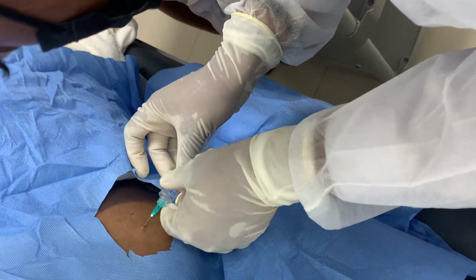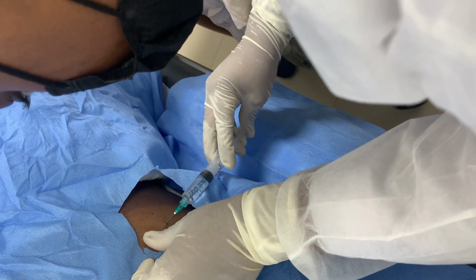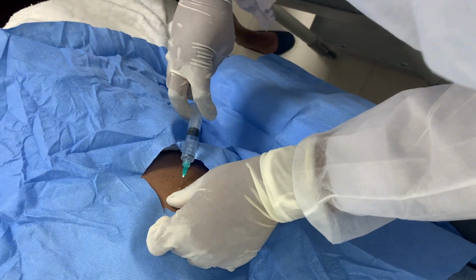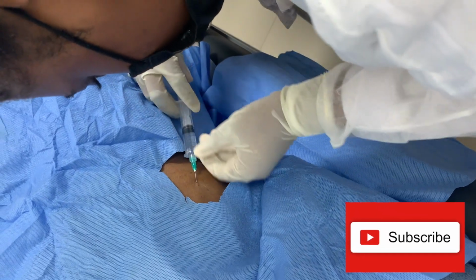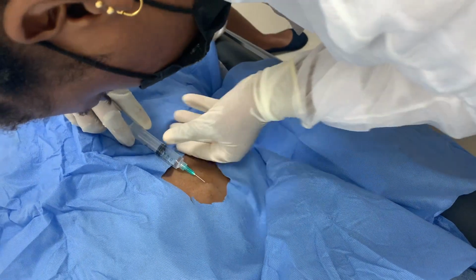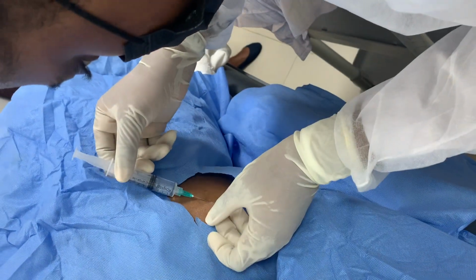So from years of medical school, you know that in layman terms, whenever there is salt, water follows. So there's retention of sodium and water is retained in the body. These patients end up having edema, can have peripheral edema, pitting edema, can have periorbital edema. In this case, this patient has ascites. And what we're doing here is paracentesis, also known as tapping.